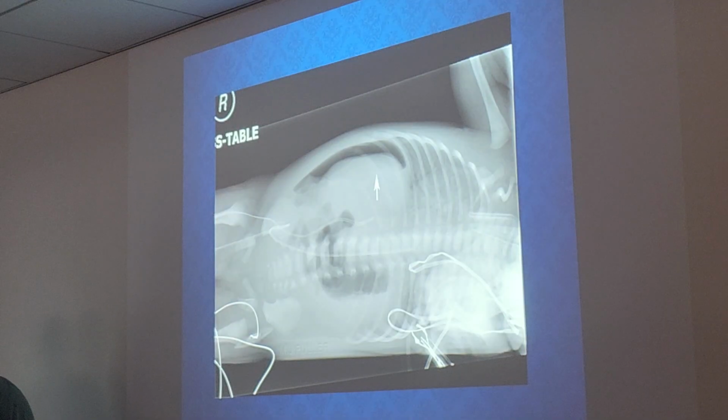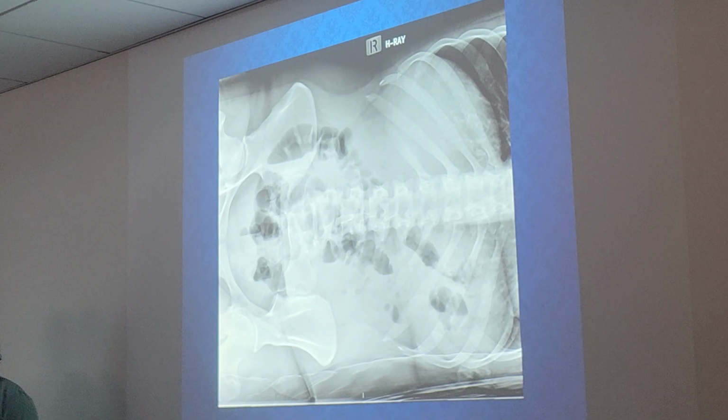How do you know that was a decubitus abdomen and not just a picture someone turned? Because of the air fluid level? I see the stuff at the bottom. Because the marker's straight. Because the sheets, they've been built standing up. Alright, so I heard air fluid level and I heard something at the bottom, because of the sheets that are going up. Yes, very good. So you can see the artifact from the sheets holding up the patient. And yes, you can also see the air fluid levels in the colon there.